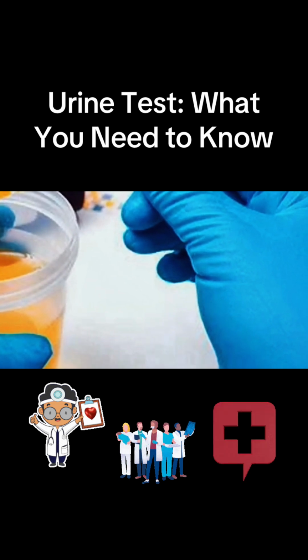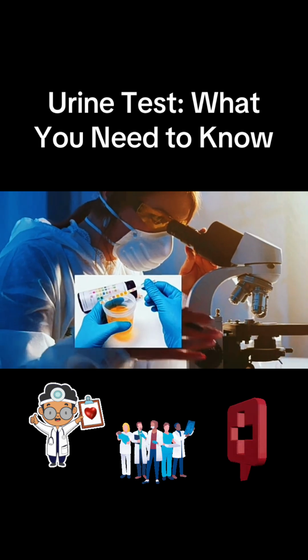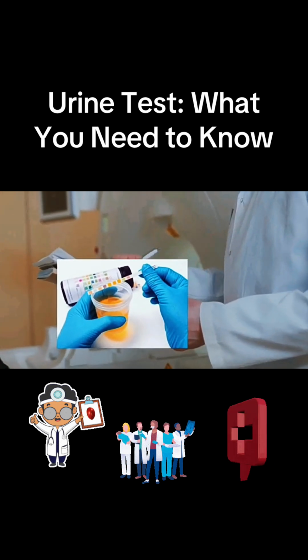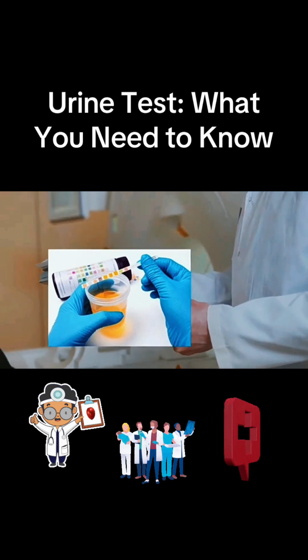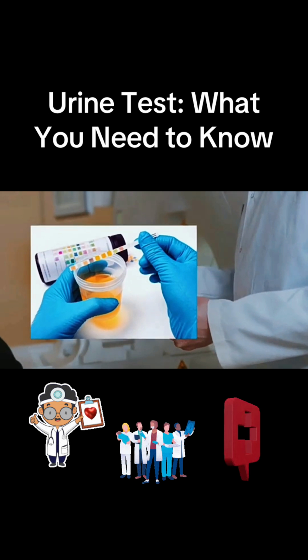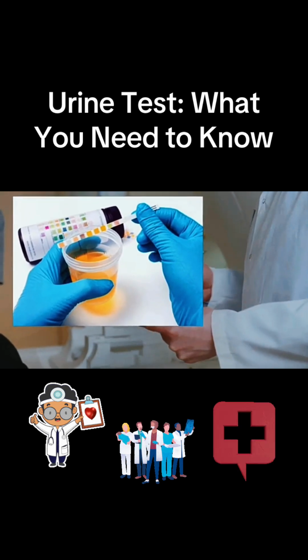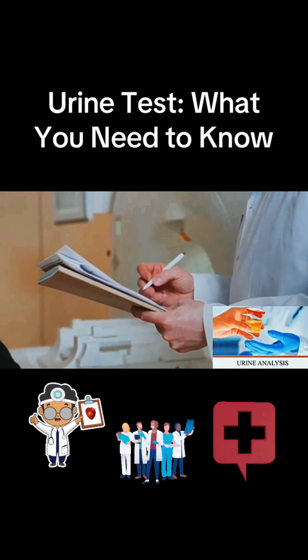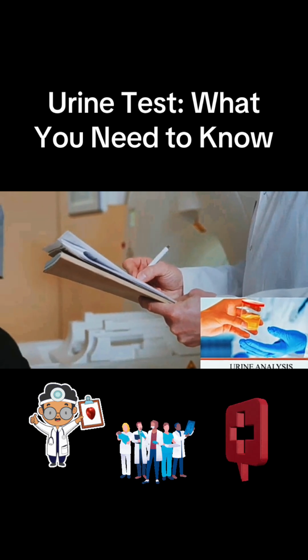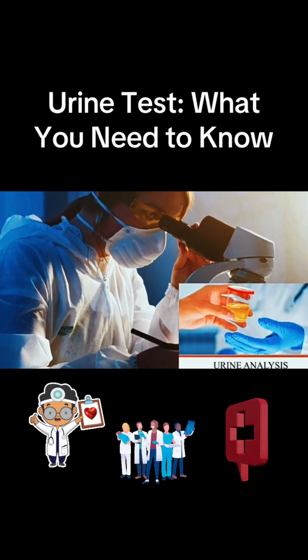Color and appearance, chemical findings, microscopic findings. Urine color and appearance. For most urinalysis tests, a healthcare provider examines how the urine sample looks to the naked eye. They check if it's clear or cloudy and if it's pale, dark yellow, or another color. Normal urine color is usually some shade of yellow and can range from colorless or pale yellow to deep amber, depending on how concentrated or diluted, watery, your urine is.